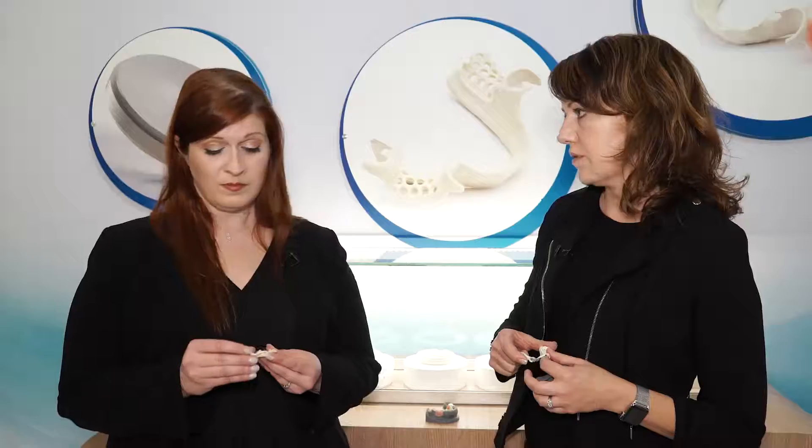As a prosthodontist, I get a little concerned about not being able to have rest seats on my RPD frameworks, especially in removable partial dentures that are metal-free. I can see that there are rests here. The properties of this material really enable you to do things on the design side that typically aren't available for polymers. Rests are one of the most important pieces of that, so you can really have a tooth-borne partial as opposed to a tissue-borne partial. That's excellent because we know that will positively impact periodontal health.